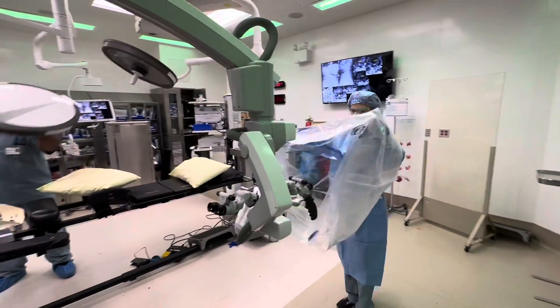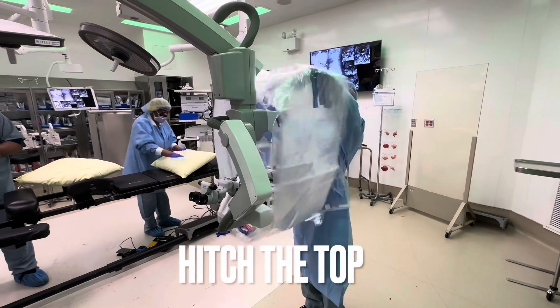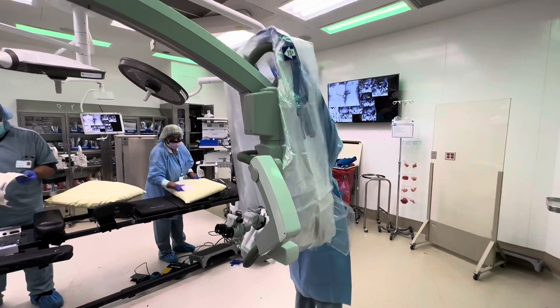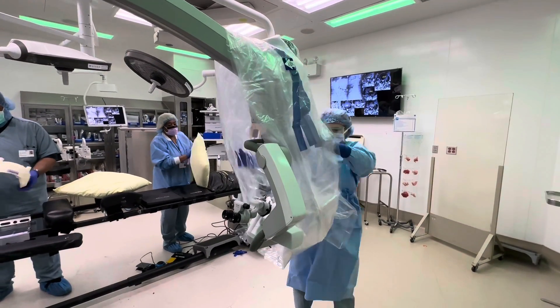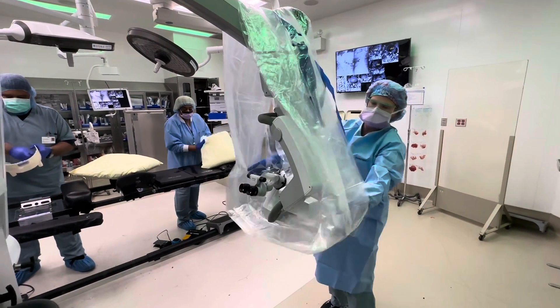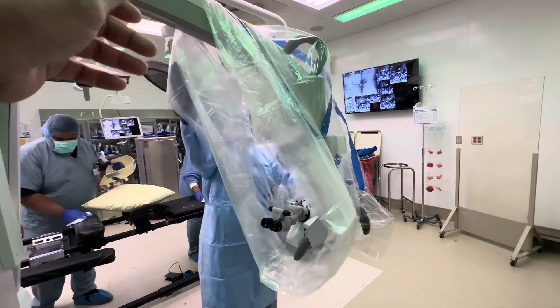Usually you put the microscope like you're going to use it. Bring it over the top — you put it over the top first so it kind of controls it on the bottom. Usually it helps to have somebody else pull, but she did it by herself.